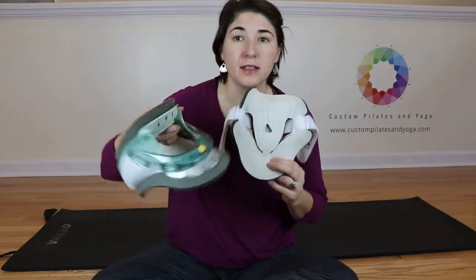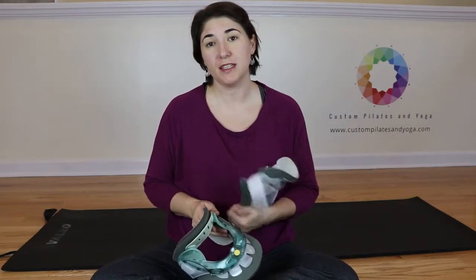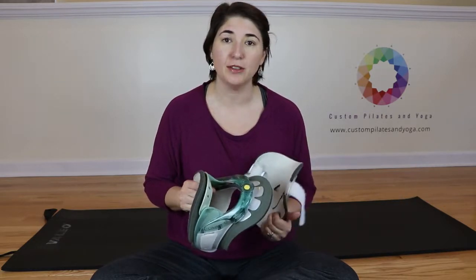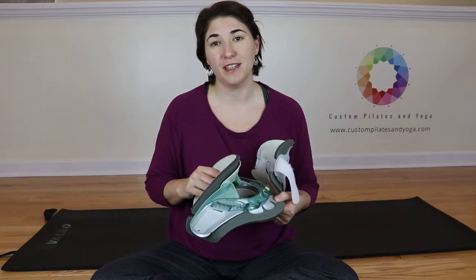And now my collar's all ready to go. I hope that this has helped you learn how to adjust your Aspen Vista collar safely and given you some good ideas about how to have a less stressful time wearing your Vista.